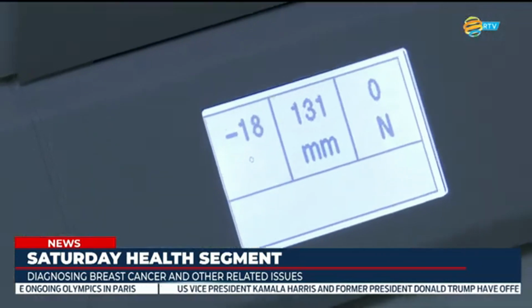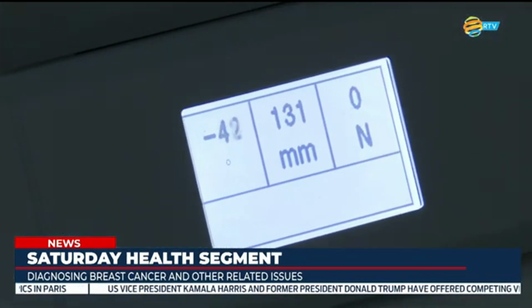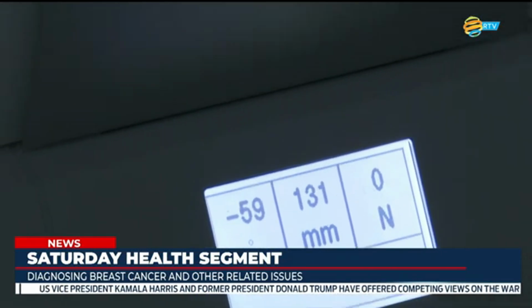With this machine, let us refer to a mass or a region which is in the breast. A trained radiologist categorizes the tumor regions that are there into malignant or non-malignant, benign regions. There is even a percentage probability of whether this region is malignant or not. So with that probability, if the probability of being malignant is more than 2%, then it is a candidate for biopsy to confirm.